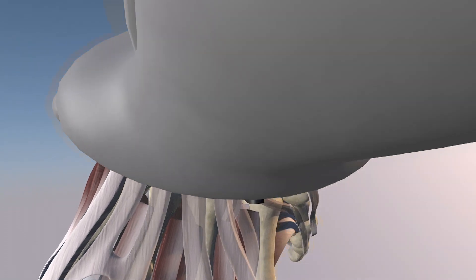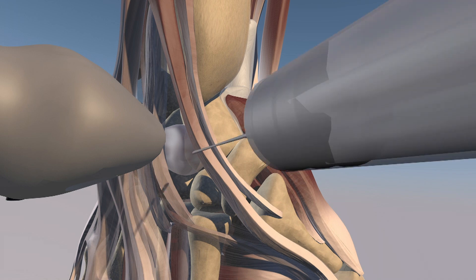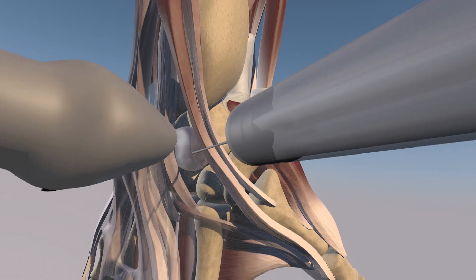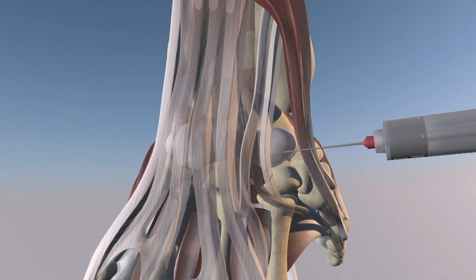This is the probe position — it's in a dorsal axial position. It's going to be an in-plane approach. Here's the needle and the syringe, just parallel to the probe. The needle is going into that most radial aspect of the cyst.